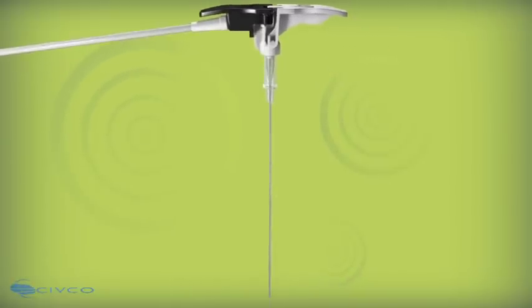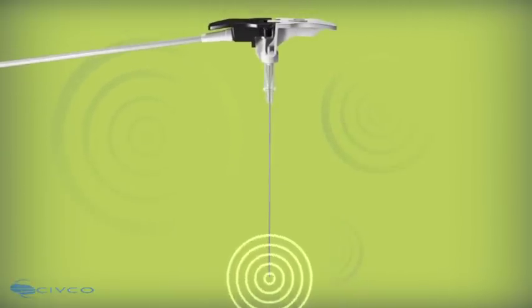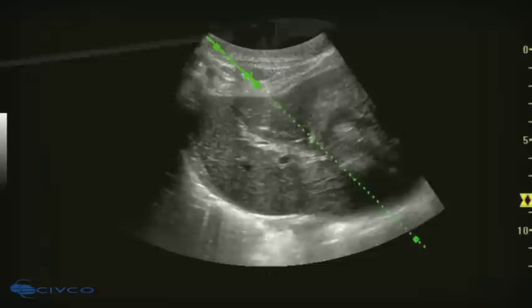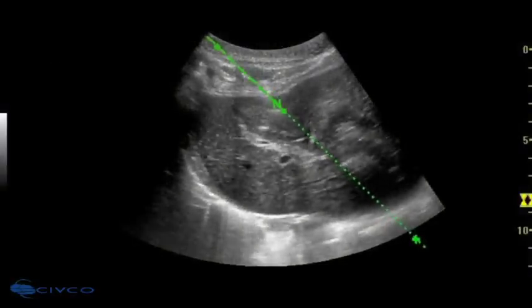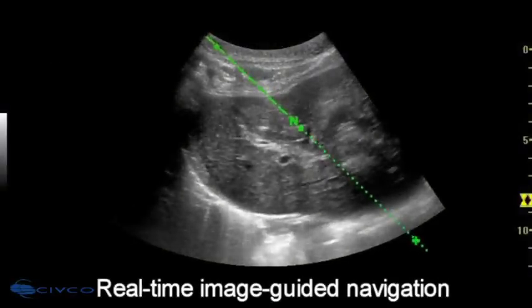The eTrax guidance system features a sensor embedded into the needle tip, giving physicians a more dynamic and accurate tool for tracking the tip of a needle under real-time image-guided navigation.